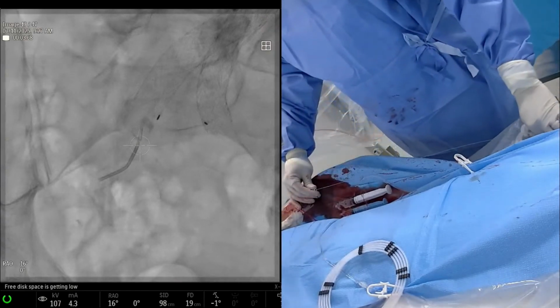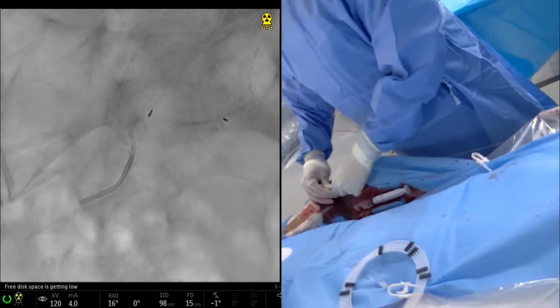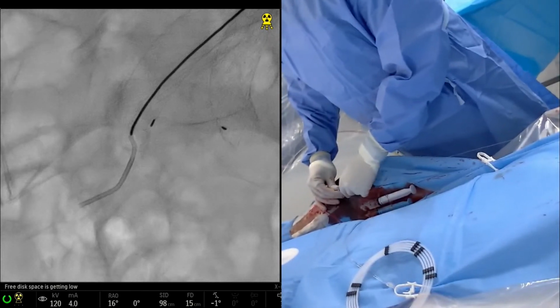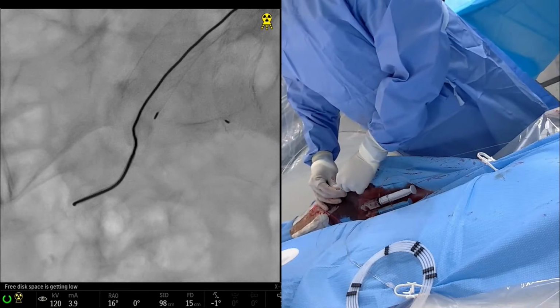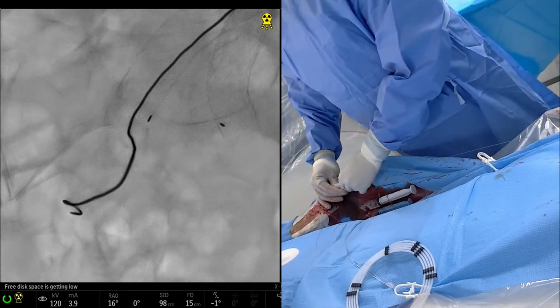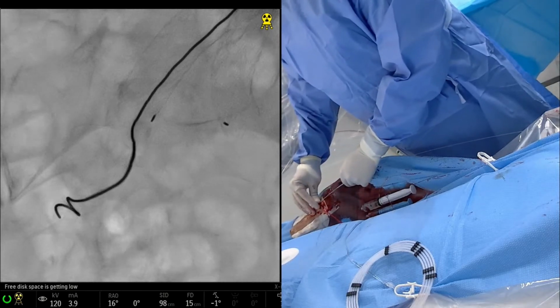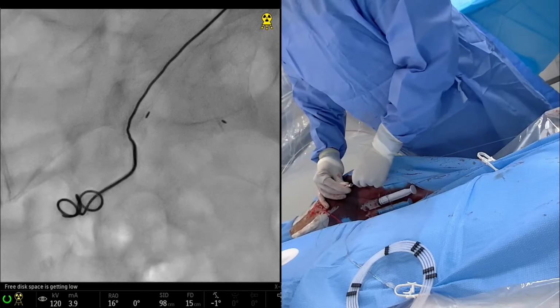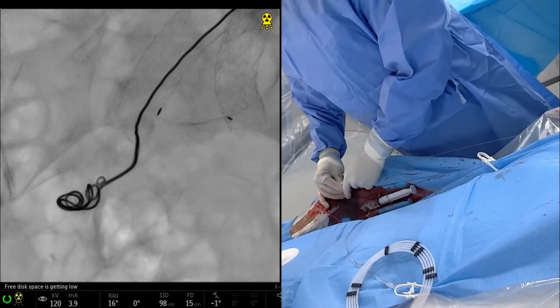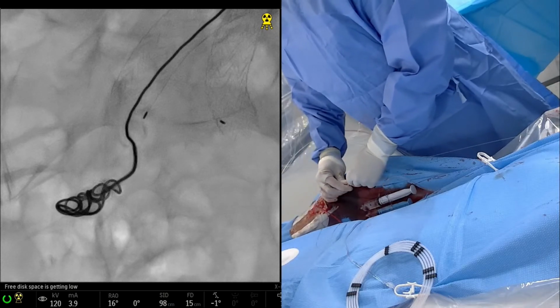I'm going to mag up a bunch just so you guys can see this coil come out. Here it is. Man, that is a huge coil. I'm going to form the coils pretty well there. I like it. Yeah, that's perfect, right? Give it a little room here. And now we should be into the softer packing portion of the coil.